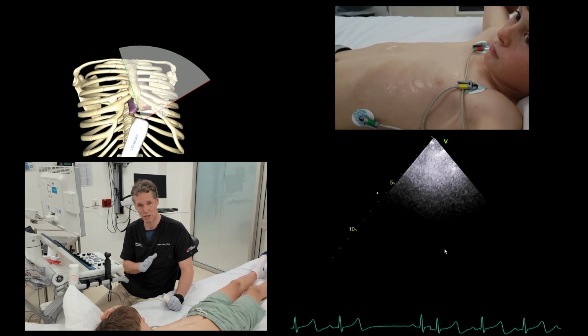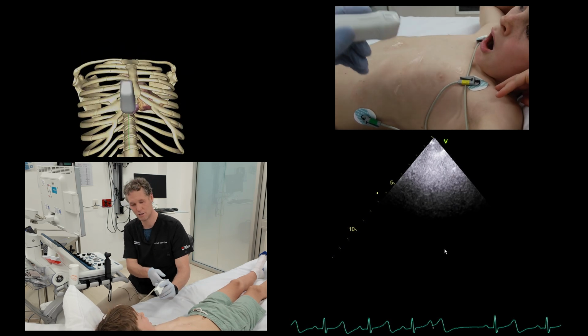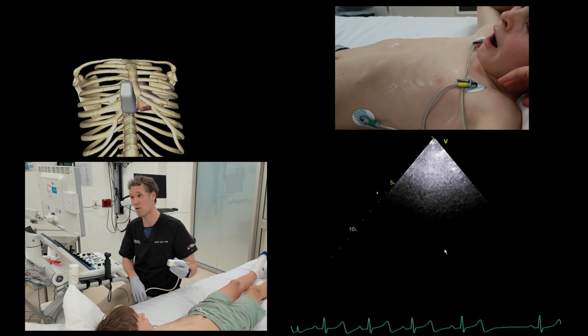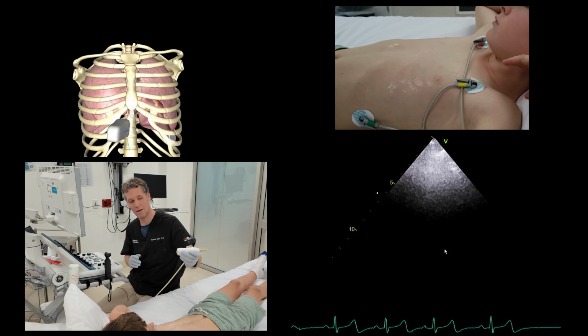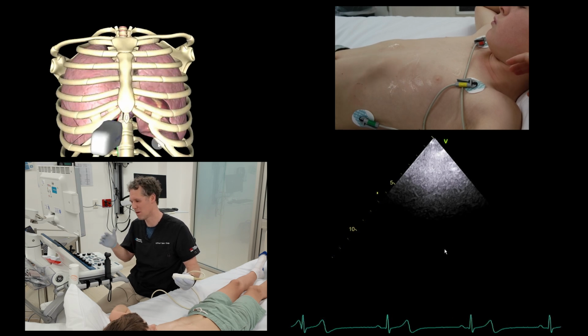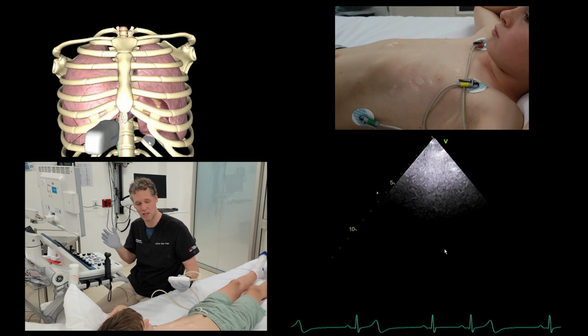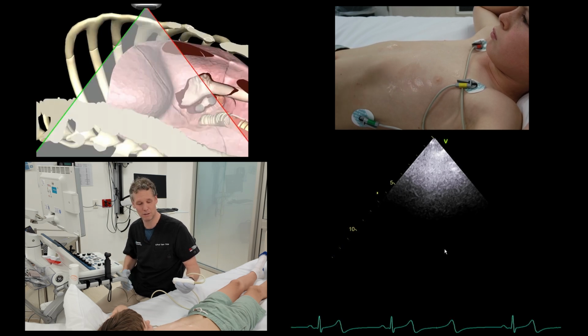The last little bit I'll show you is lung ultrasound, okay? So lung ultrasound, I use the same probe. If you've got a preset for lung ultrasound, use that, because you're going to want to try and do artifact suppression. One of the things that we might be able to do on this echo machine would be to try to turn off harmonics and things like that, but if you've got a preset, much better.